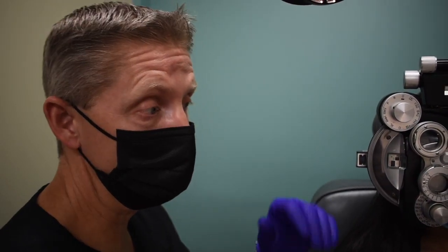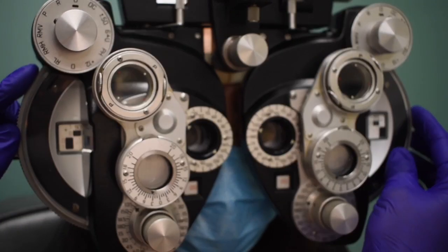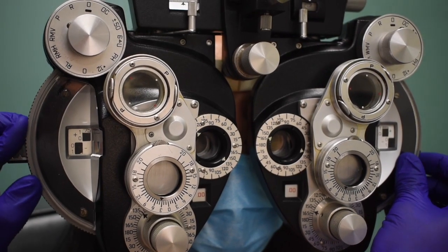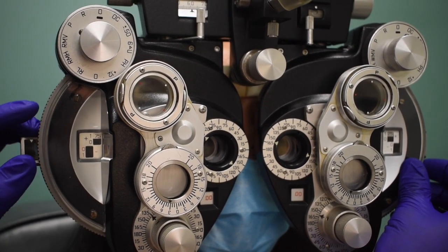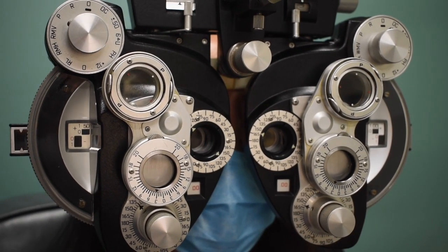Okay. Now, right there you heard Mrs. Jones hesitate a little bit, so there's some question as to whether that one was as clear as the one before. So this is where we'll give her a forced choice and see which one she actually prefers. Now, is it better here with number 1, Mrs. Jones, or here with number 2? Number 1. That one's just a little bit better? Mm-hmm. Okay. So Mrs. Jones right here is telling us that this is the most plus that she wants for this target at 40 centimeters.